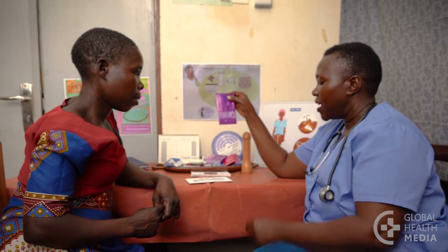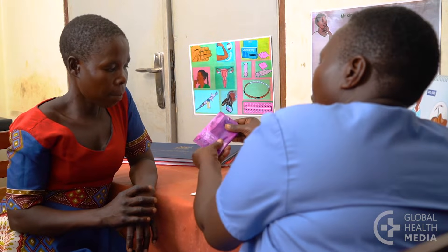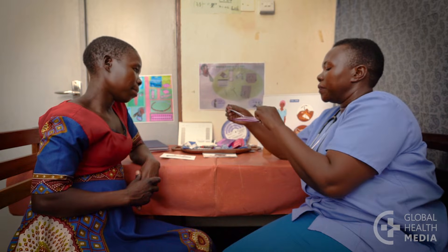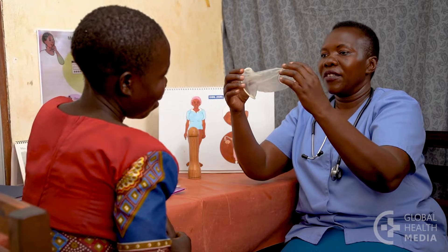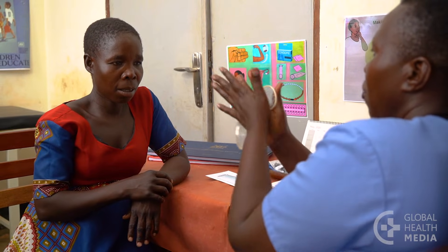First, show the woman how to check the package to be sure it's not damaged or expired. Find the notch to easily open the package. Show the woman what the condom looks like. Then rub the sides together to spread the lubricant evenly.